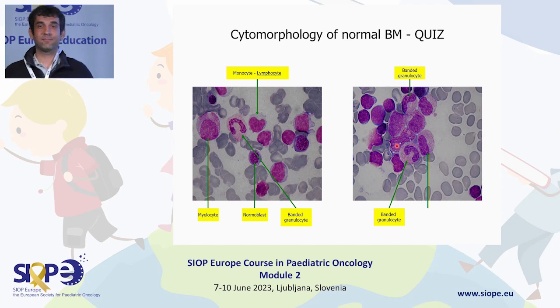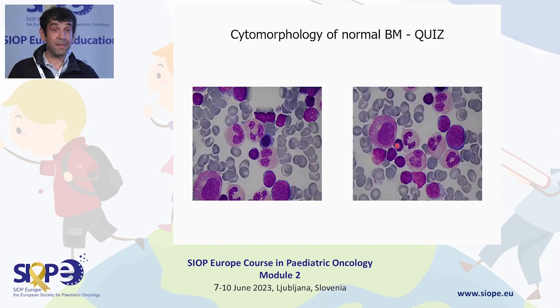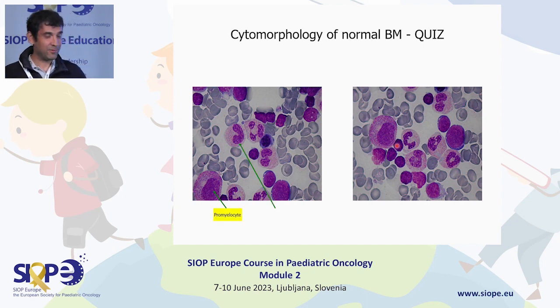And what's this? What's this? It has no perinuclear lightening, but it's not like the cell. Myelocyte? Yeah, correct. Good. And a metamyelocyte. Sorry, metamyelocyte. Good. Next cell here, a very big cell, blue cytoplasm, perinuclear lightening. I think that's a promyelocyte. Yeah, that's correct.